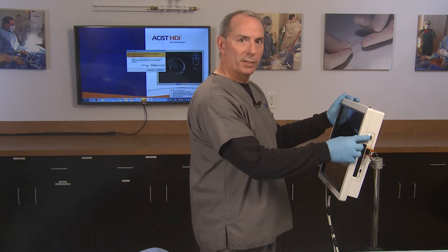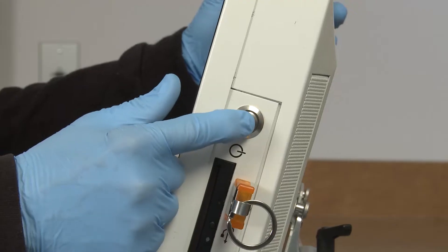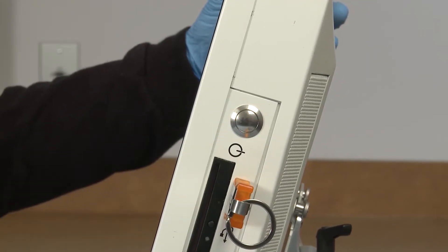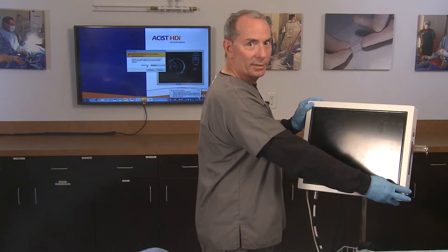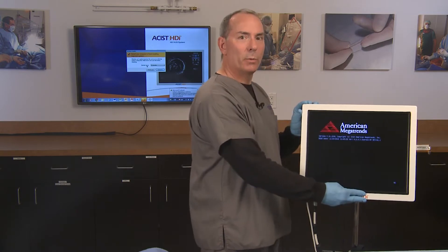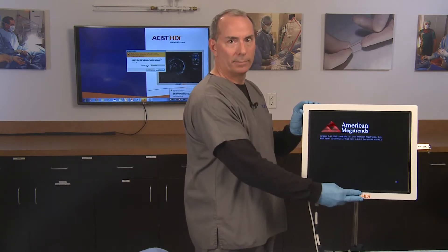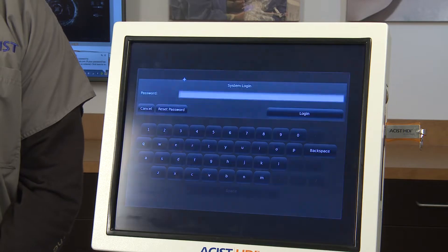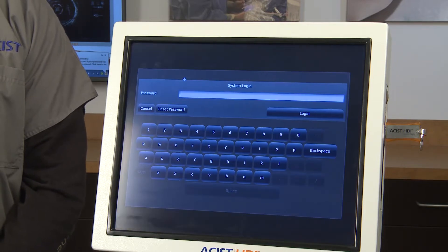To power on the system, press the power button on the side of the system console. A system self-test and start-up sequence begins. When the power-up sequence completes, system login appears.